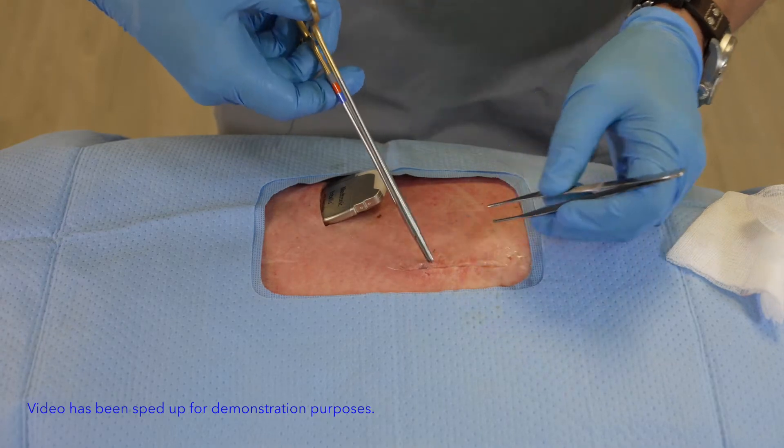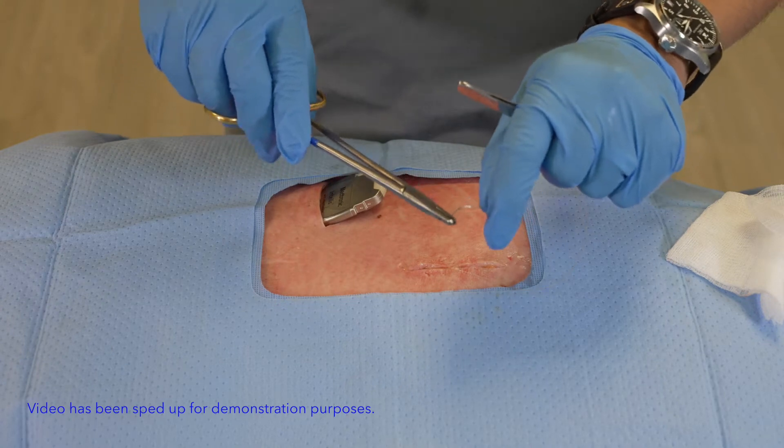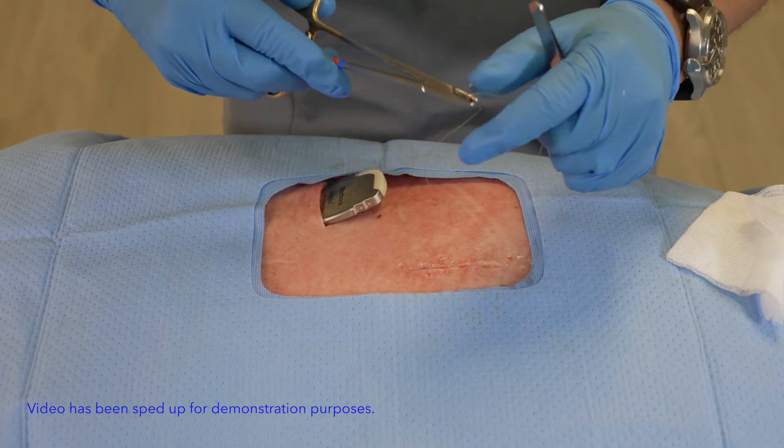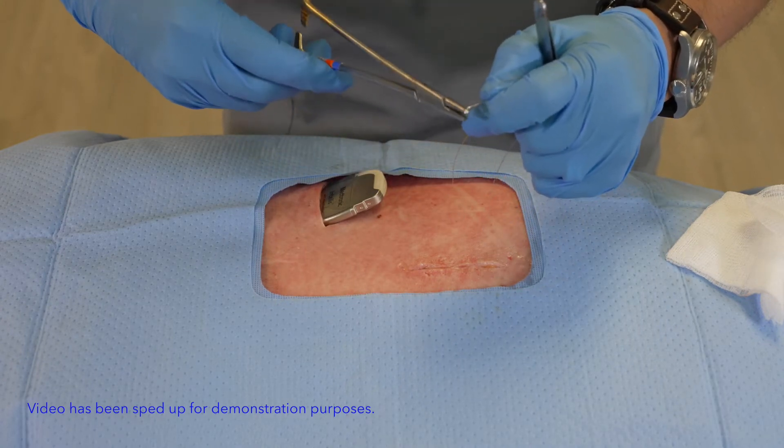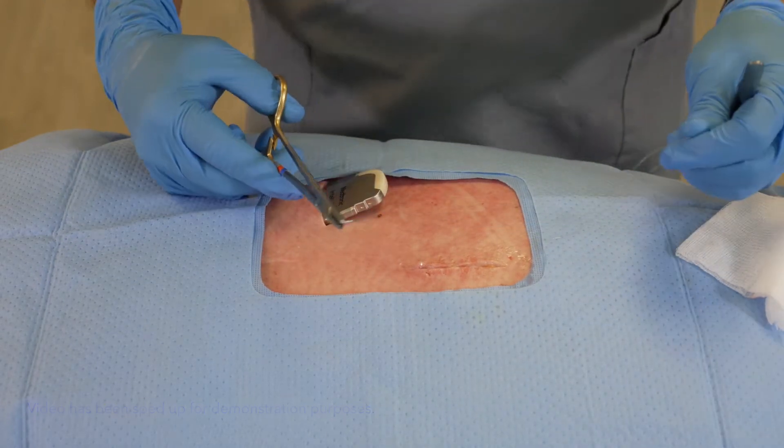Once I've done that, the real advantage again is the ability to pass the needle through the loop, and once again I've been able to secure my suture down.